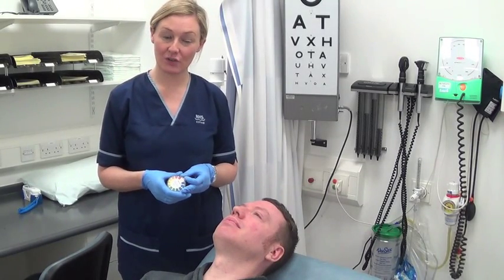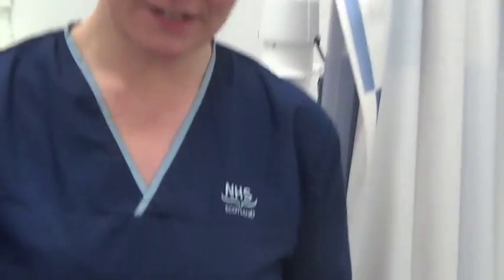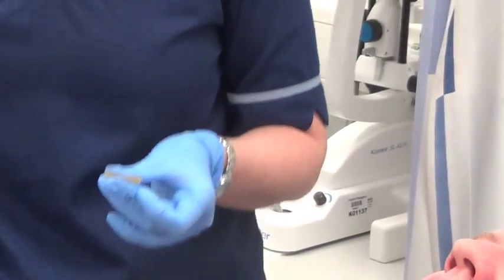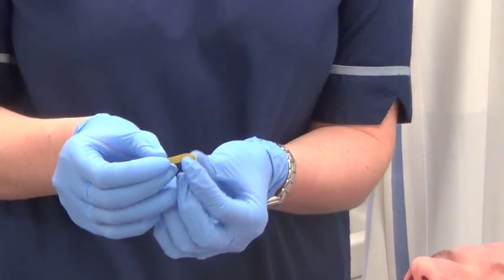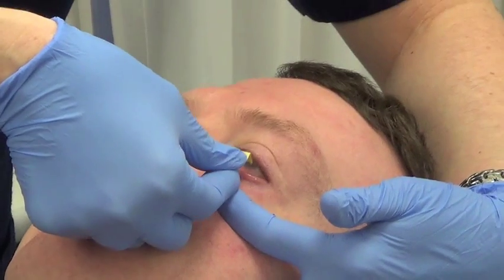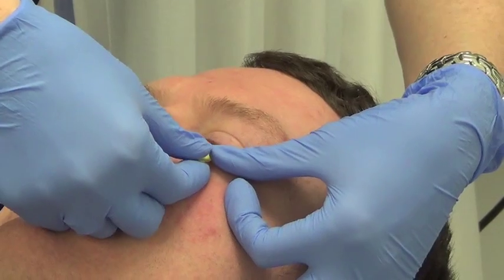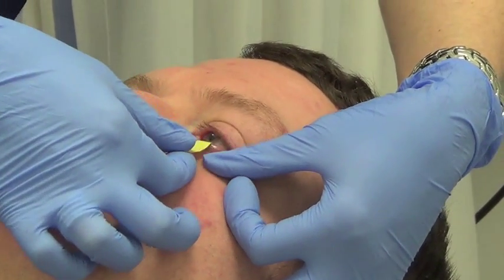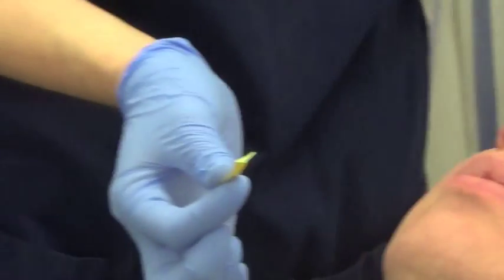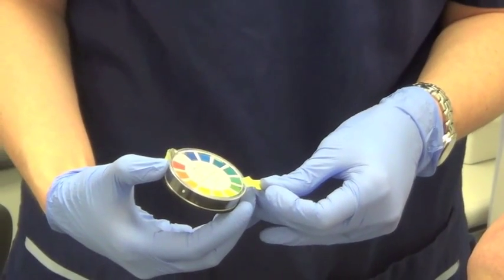To check the pH of an eye when there's suspicion of a chemical injury, take a piece of litmus paper. Fold over the end, retract the patient's lower lid, tuck the paper into the conjunctiva and hold it there for a few moments, then remove. Using the guide on the coloured wheel, you can establish the pH of the patient's eye.